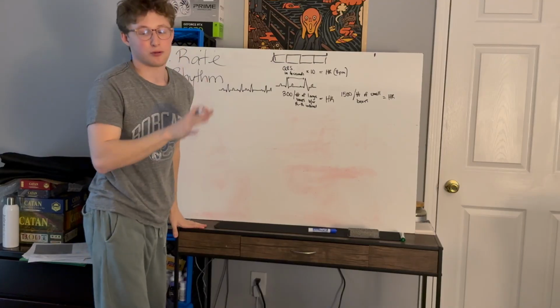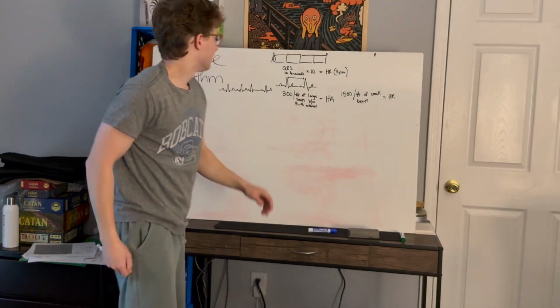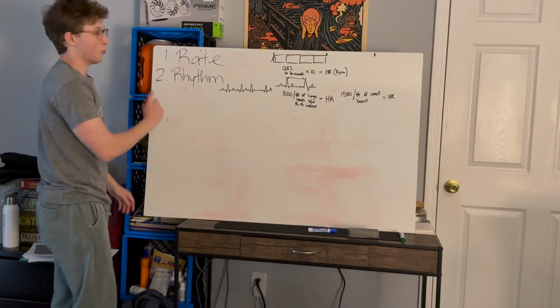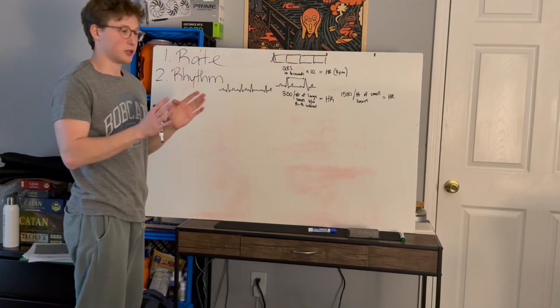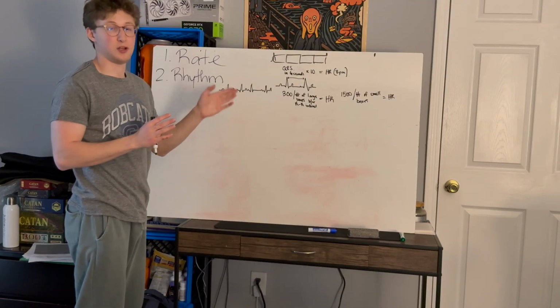Again, I'm going to go through this many times when we look at the individual strips, so it's not perfect, but rhythm is when you look at your QRS complexes or your P waves.